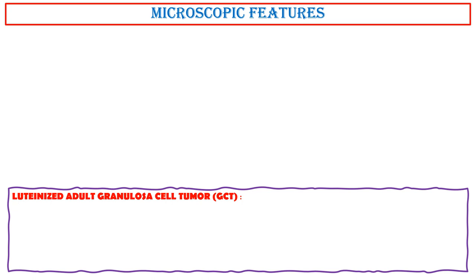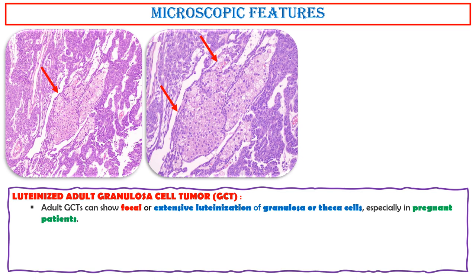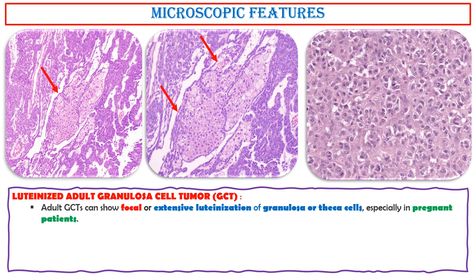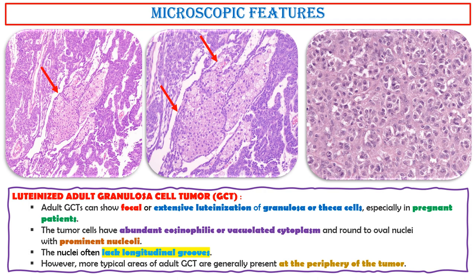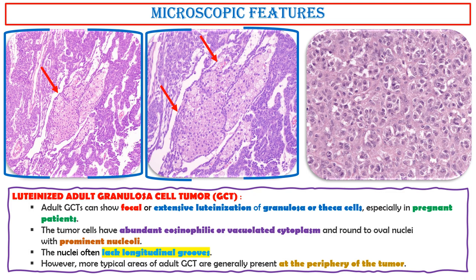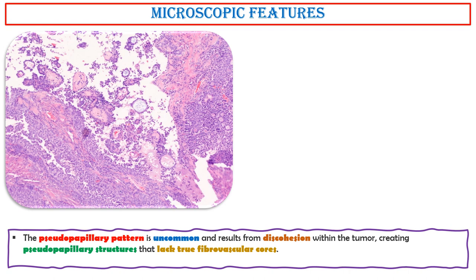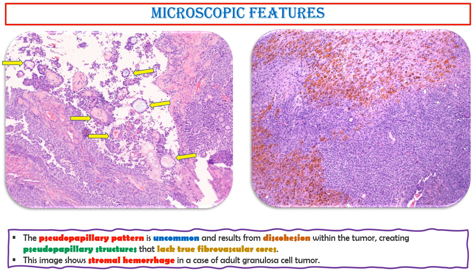Luteinized adult granulosa cell tumor. Adult granulosa cell tumors can show focal or extensive luteinization of granulosa or theca cells, especially in pregnant patients. The tumor cells have abundant eosinophilic or vacuolated cytoplasm and round to oval nuclei with prominent nucleoli. The nuclei often lack longitudinal grooves. However, more typical areas of adult granulosa cell tumor are generally present at the periphery of the tumor. The pseudopapillary pattern is uncommon and results from discohesion within the tumor, creating pseudopapillary structures that lack true fibrovascular cores.